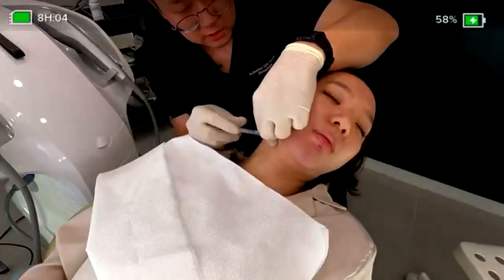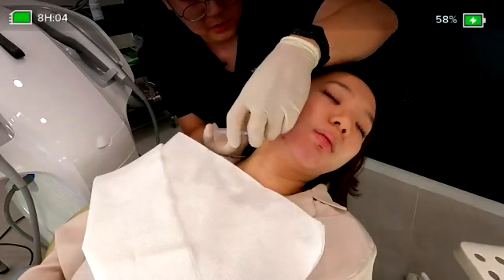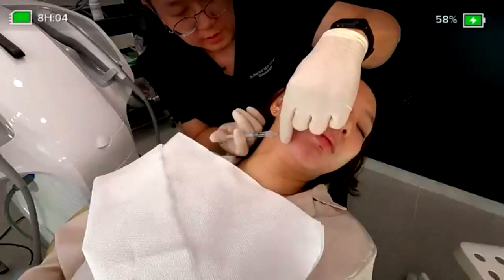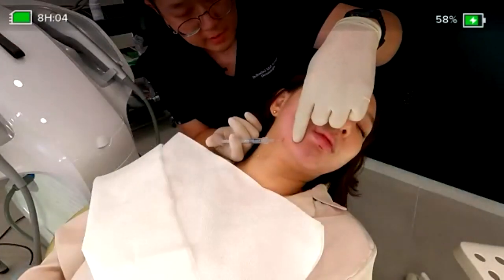Usually this one is a very thin and soft kind of filler, but sometimes it is popping up. But don't worry about this because we are not using that much filler inside, just using a very small point.